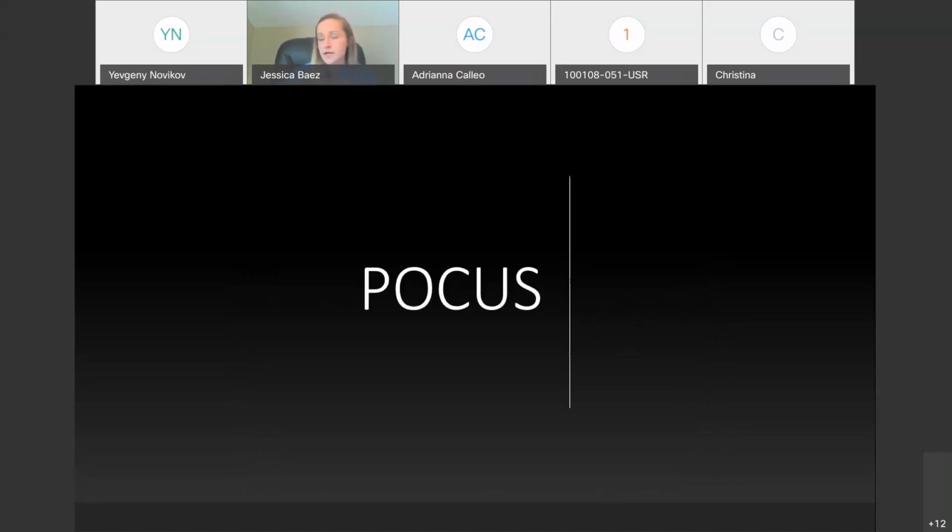So specifically, we're going to be talking about point of care ultrasound, or POCUS. And I'm making this clarification because I think it's important to understand the distinction between POCUS and comprehensive ultrasound. Because with POCUS, you are the actual operator, you're obtaining the images, and so it's important to know your limitations. Typically with this, you are answering specific yes or no questions about an organ, not necessarily getting a comprehensive assessment of the organ. So for example, with biliary ultrasound, we're asking yes or no, is there evidence of cholecystitis or evidence of gallstones, but not what the liver looks like and venous flow and all those things. And so it's really important to understand that you're asking yes or no questions.